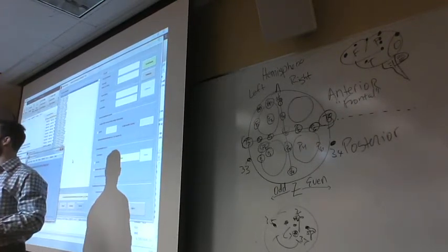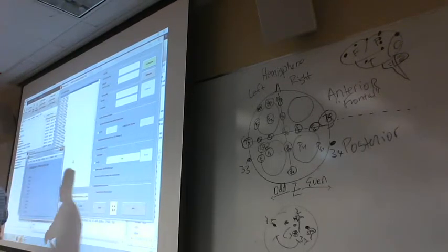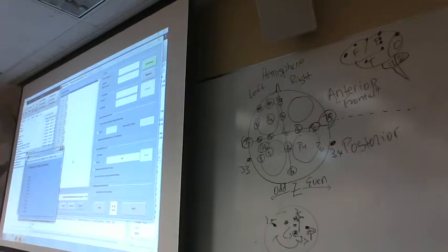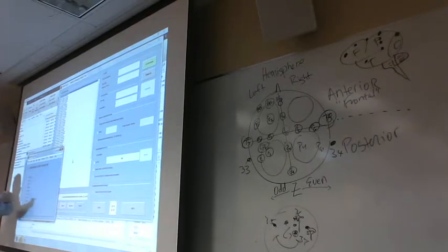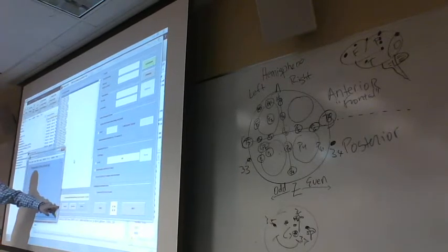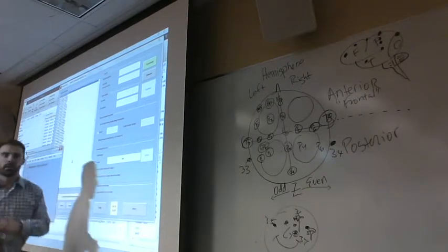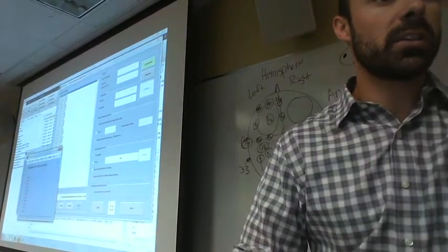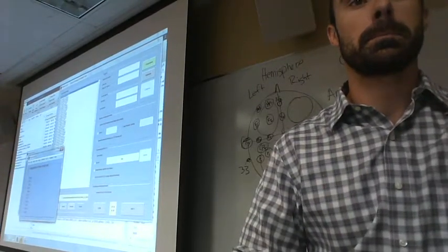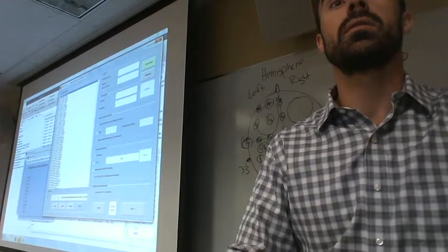If you're hired in a lab and you need to make an events list, this is how you build it, one by one. Then you go through each time down, change whatever you need to change, and set your structure for how we'll work with the data. But since I've already done this for you, why don't you come down here and go open list, load list, and navigate to the file that says Advanced Events List. Everybody have that?